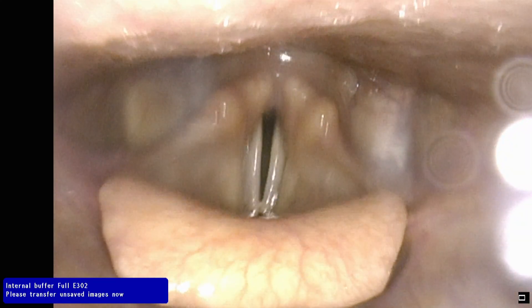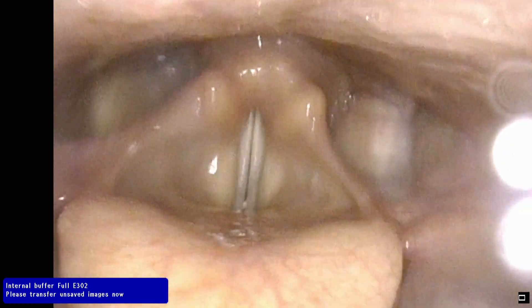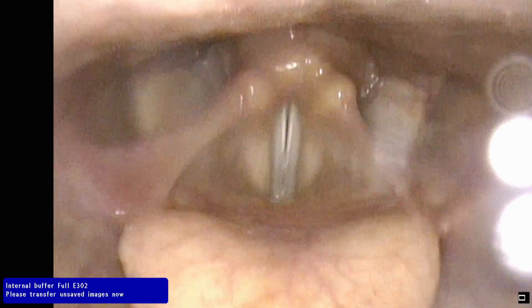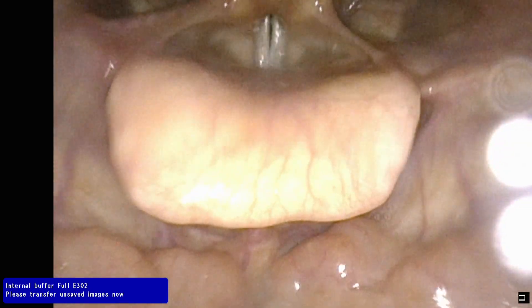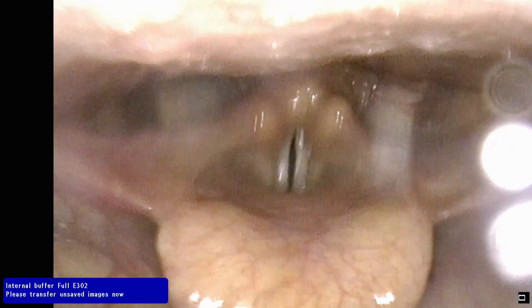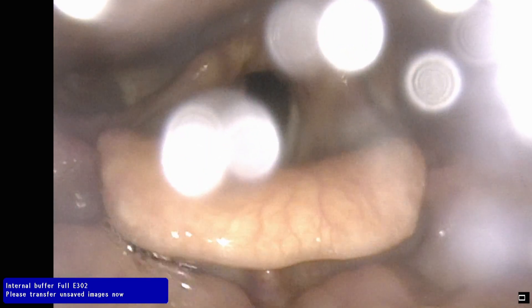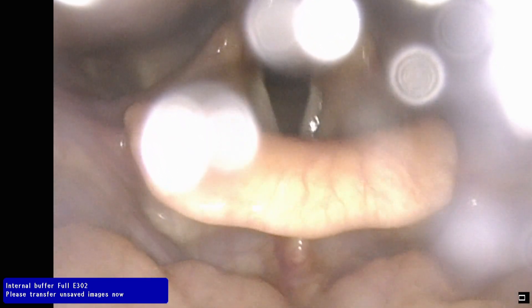Okay. Now try to go the other way. Good. Okay, Rachel, let's pull it around so she can see. Maybe a little more in front just so she doesn't have to turn her head. That's perfect right there.